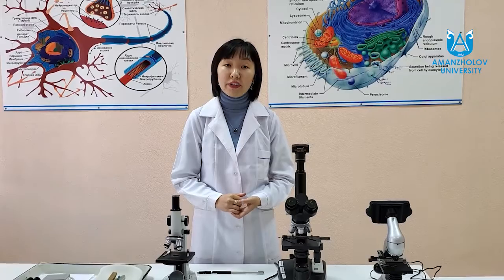It is a glass lens convex on both sides, which is inserted into a frame with a handle for convenient operation. There are handheld and tripod magnifiers. A handheld magnifier can magnify the object in question from 2 to 20 times. A tripod magnifier enlarges the object under consideration from 10 to 20 times.